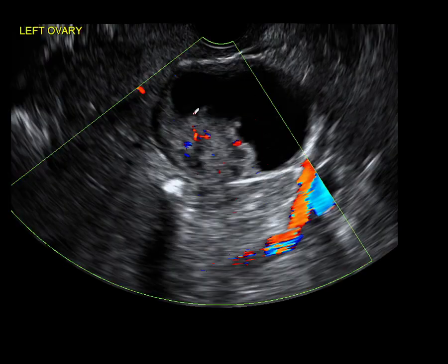Here's another patient with a rather difficult to evaluate solid lesion. You might say this could be a blood clot internally because it's rather concave. But internally there's flow within the solid component of the mass, and this was a primary malignant tumour.